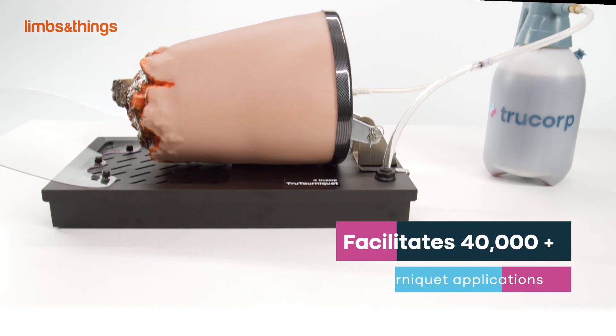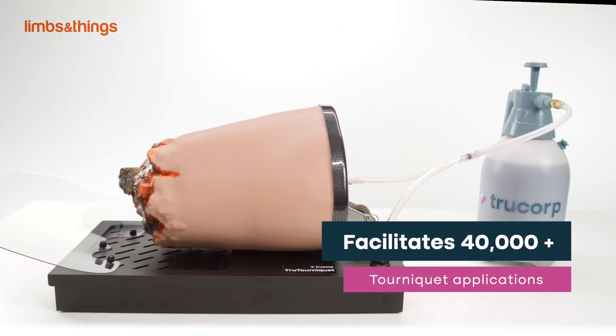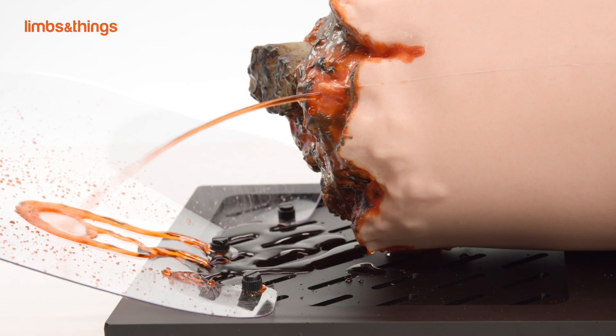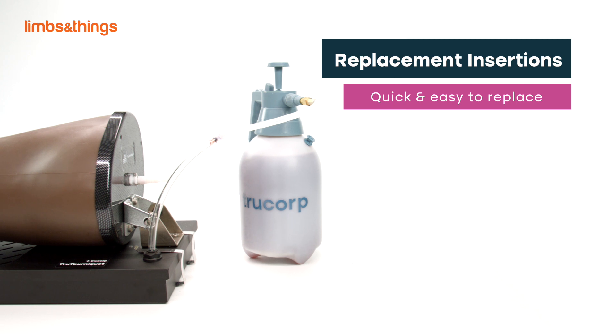True Tourniquet facilitates over 40,000 tourniquet applications without fail, and initial setup time is less than 10 minutes. The stump can be detached from the base to use in a non-classroom environment.